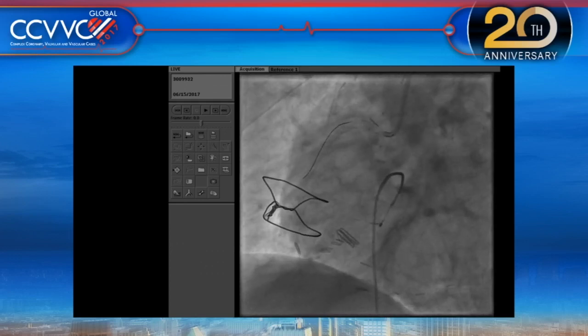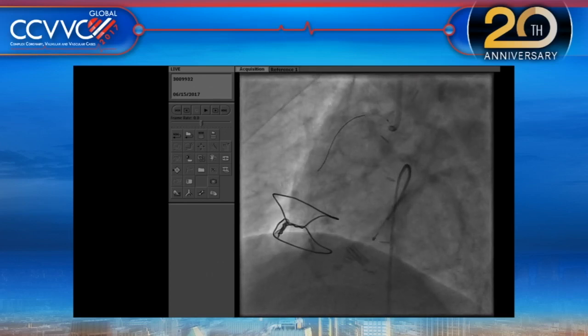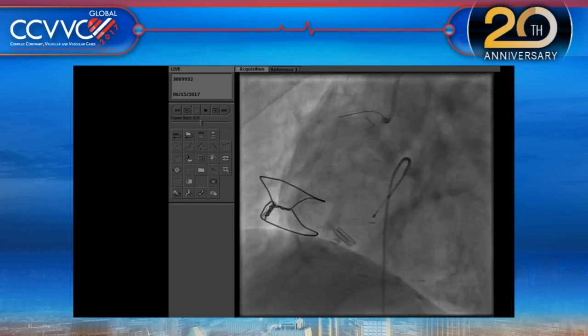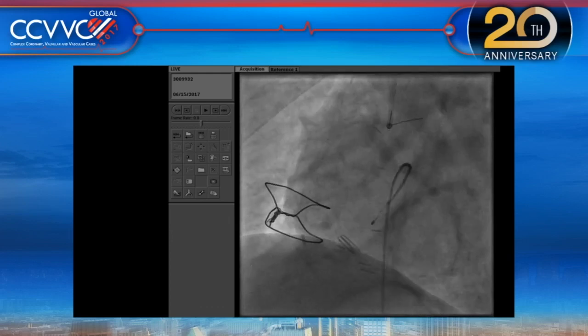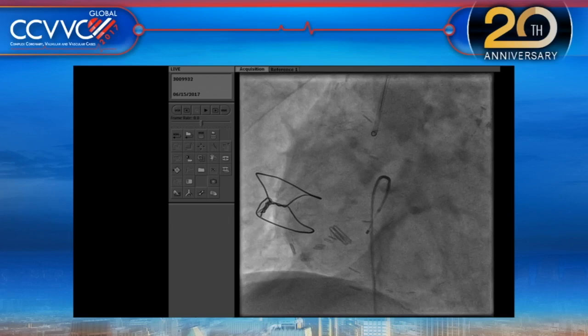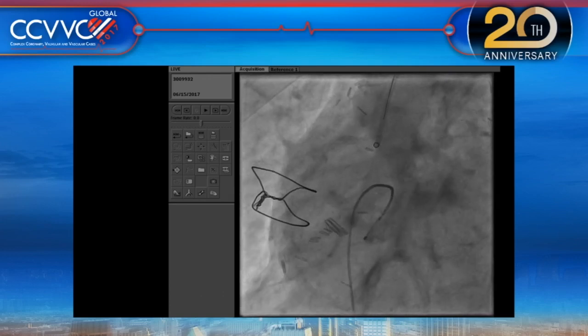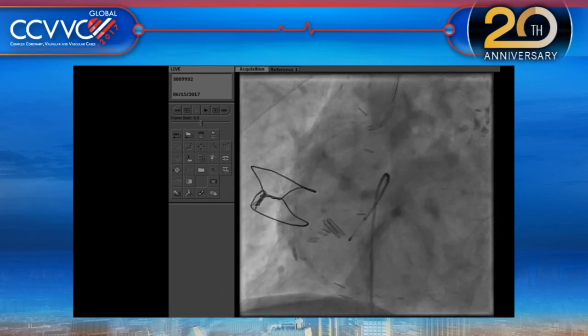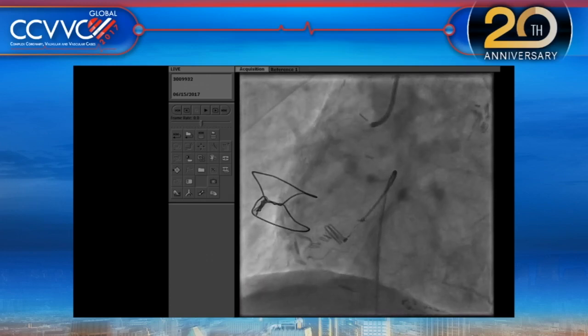I think everyone is struggling with the guide. Trying to get coaxial with the guide is sometimes trial and error with these, because they're protruding out a millimeter or two. There's a specialty guide that we use for high anterior rights that might work in this case where the stent is sticking out. It's called a Medtronic 3D right catheter. It has a curve to it, then it points at it. It doesn't provide great backup and support, but it will be coaxial. Should allow you to get a wire down.